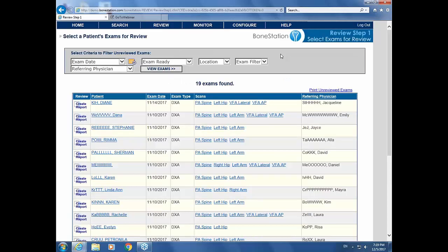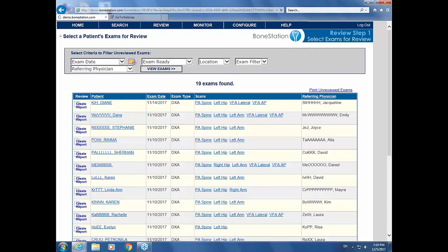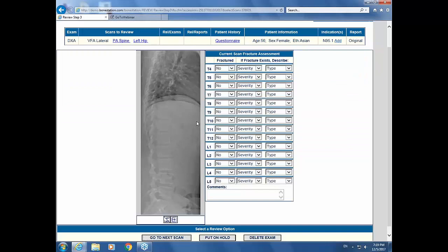If we have time, I'd like to show one more case — when there is a VFA, or vertebral fracture assessment. We go to this patient, and Review Step 2 brings us to an AP and a lateral spine view. The VFA is acquired, according to ISCD, either when the patient is over 70 years old, when there's been height loss, or when there's steroid use.